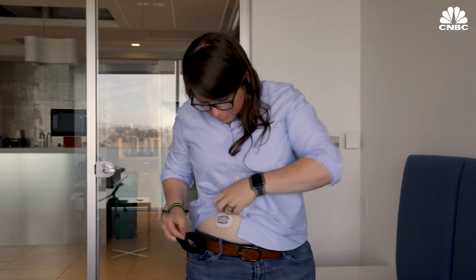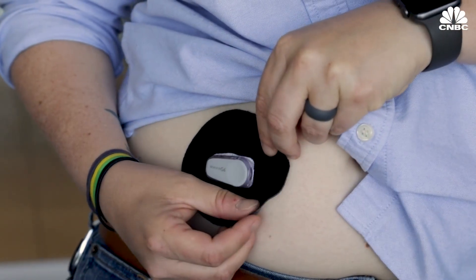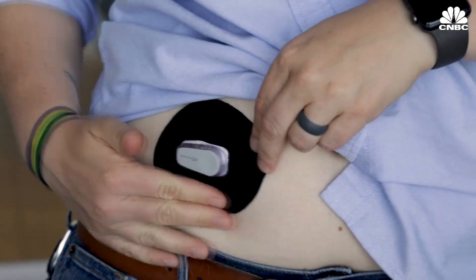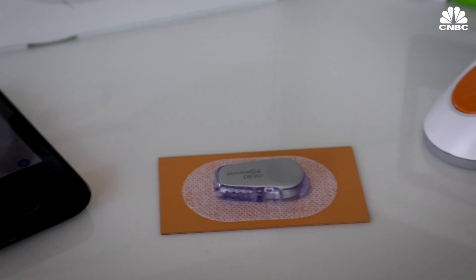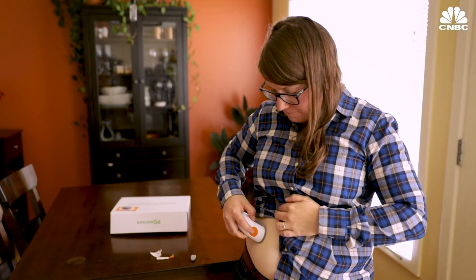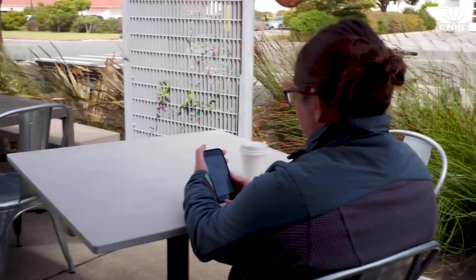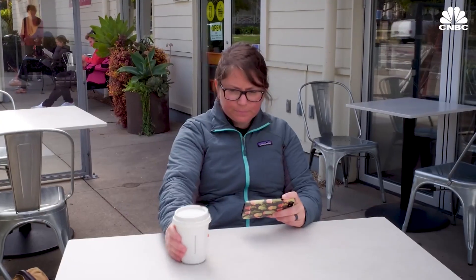Something I don't love about the new G6 is that the adhesive is the same as the G5. So after a few days of wearing the sensor, it starts to come off, which means you're going to need extra tape to keep the sensor in place. So would I recommend the G6 to other type 1 diabetics? Absolutely. It's the best CGM that I've ever tried. It's easy to use, and not having to prick my finger all day has been awesome.